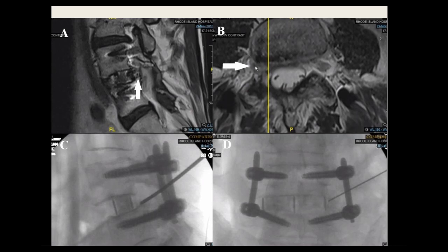He has a large foraminal disc herniation. And I show this one because in this case, I got a large spinal fluid leak. You see the sequential dilator docked on the superior end plate of L5, and then I'm just approaching the medial wall of the pedicle here. So when I introduced my last reamer to open up the foramen, I got high pressure spinal fluid out.